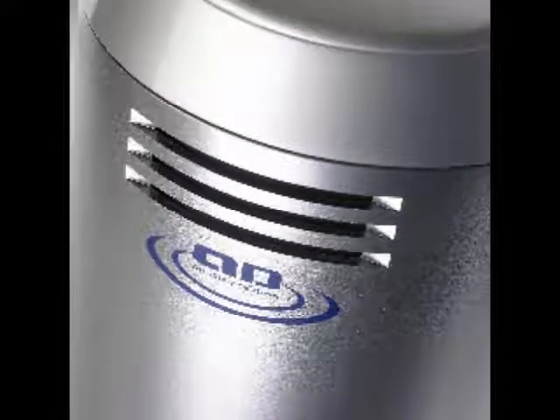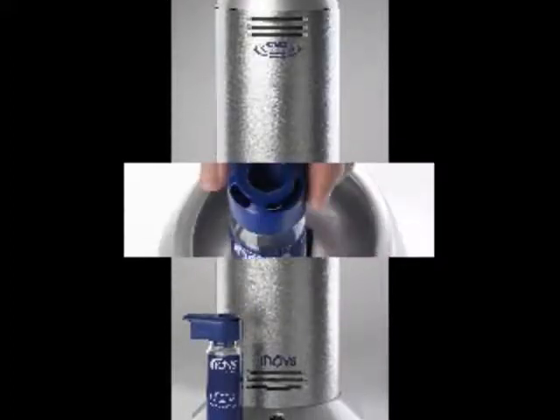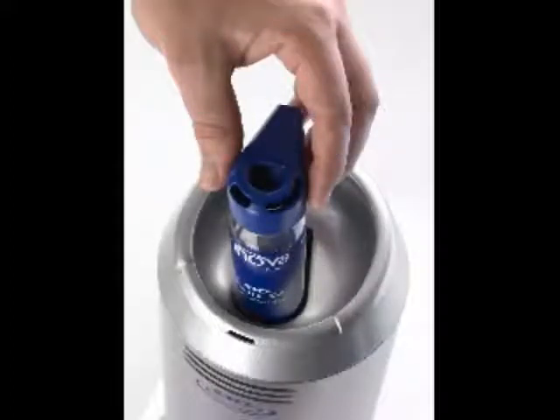Morning, Leslie. Good morning, Mike. So what's this thing you've brought in with you? Well, this is called an air disinfection device, and we're piloting it to see if it can reduce the load of airborne bacteria and spores on our infection control ward.